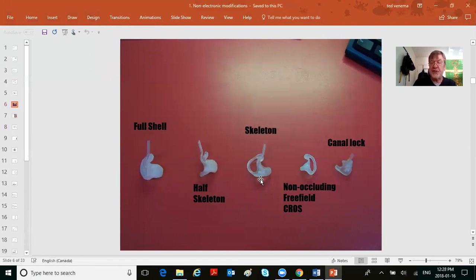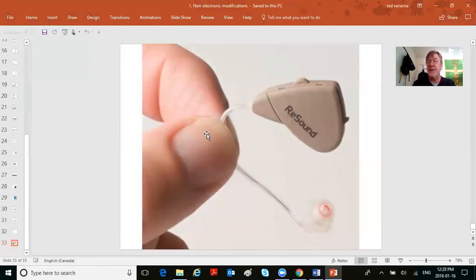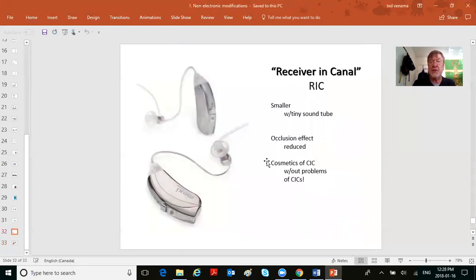And then when you've got different situations happening, we can go all the way to the end. This would be for moderate losses or a mild to moderate. Here, look at your dome. Huge holes in it. Great big holes in it. Okay, look at the holes in the stock dome. Huge vents. Okay, because most people have good hearing in the lows and it slopes down to worse hearing in the highs. So stock dome ear molds are the most common today. But once in a while, the person won't be able to benefit from that. Sometimes you're fitting a more flat loss. And then this won't work anymore. And you'll have to use a bit of a lucite ear mold along with your receiver in canal hearing aid.